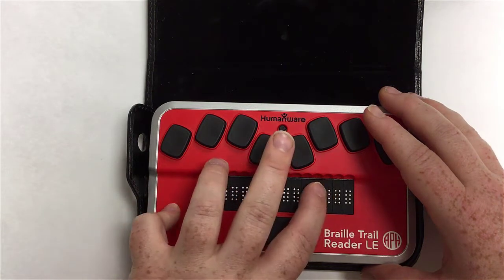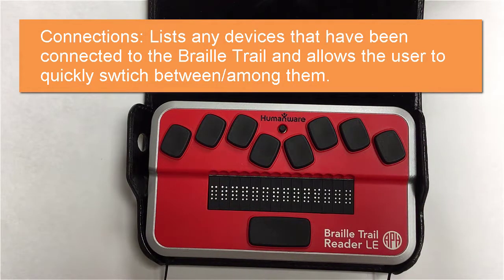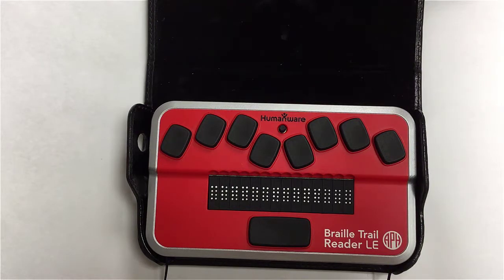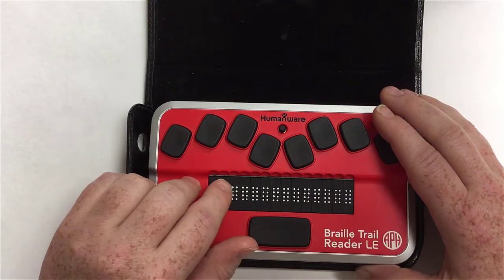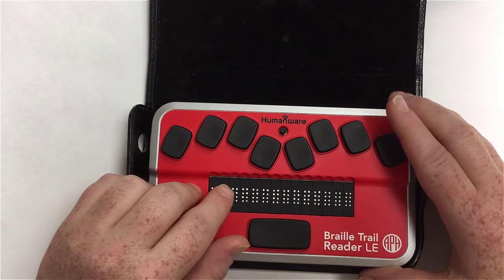The next menu is connections. This lets you very quickly and easily switch between two devices that are both connected to the Braille Trail at the same time. Rather than having you or a friend go into the phone's settings and manually disconnect, you can just go into the connections menu on the Braille Trail and do it there. It's a nice option.